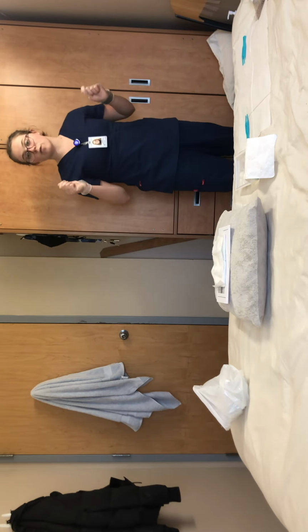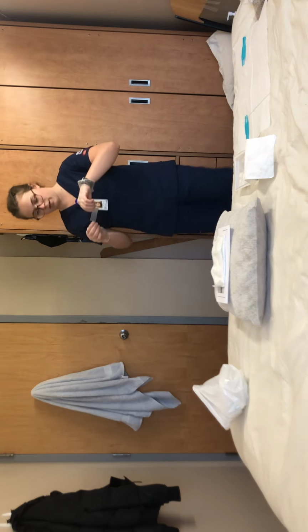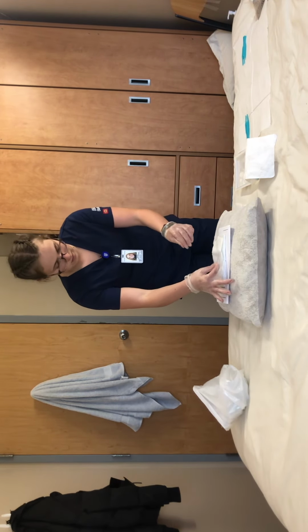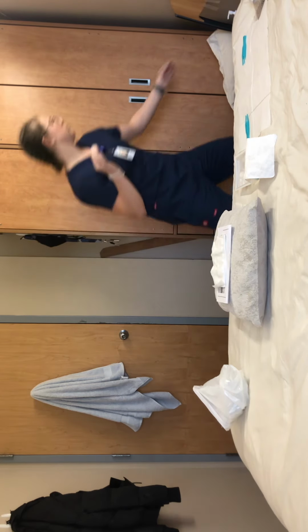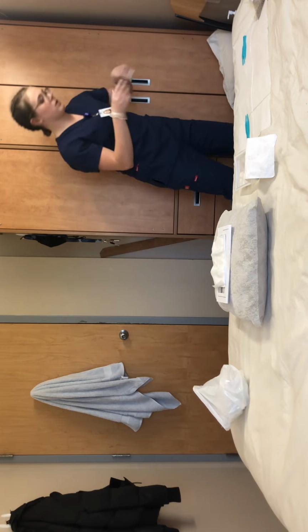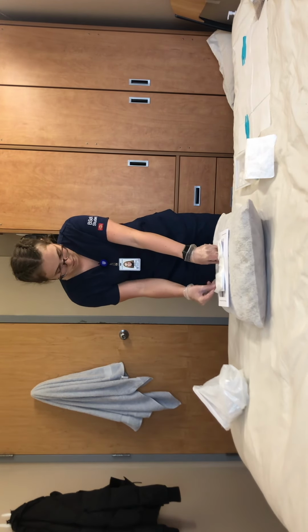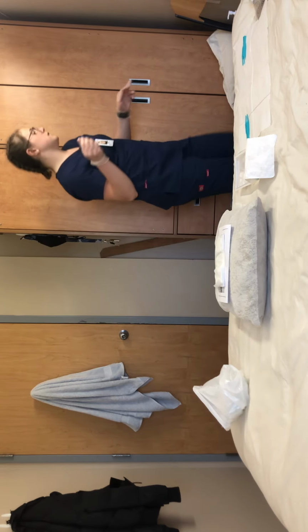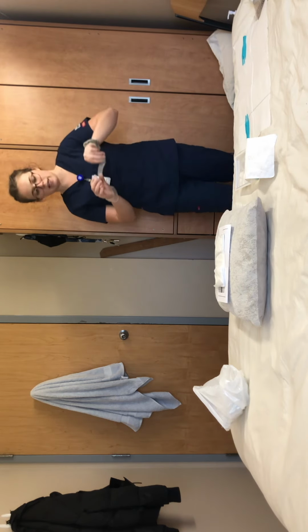Then I'll be using tape to secure the dressing. And I will also be using one piece of tape that is labeled with the date, the time, and my initials on top of it.